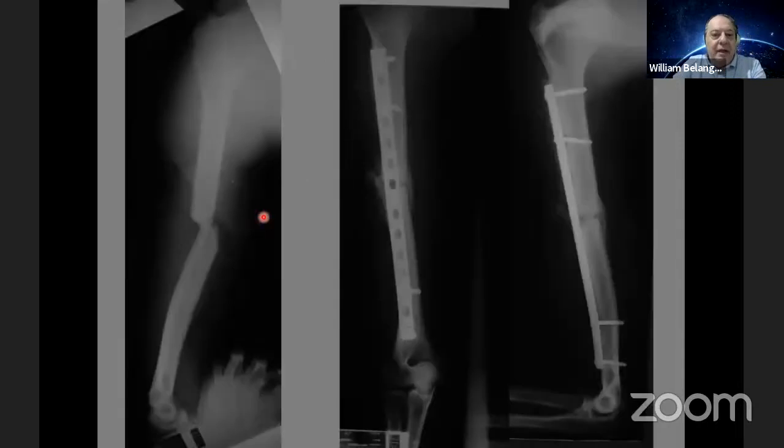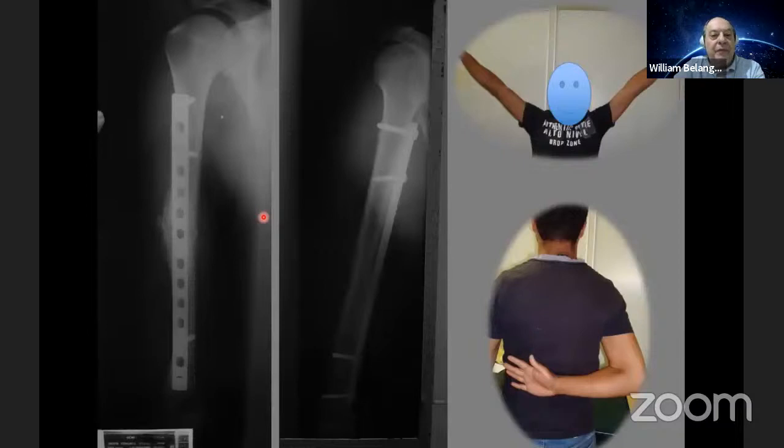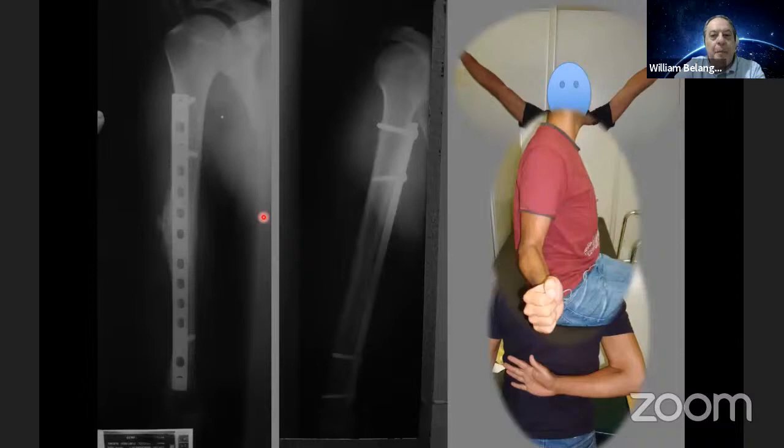You see, this is a transverse fracture treated in the correct way: long plate, 2 screws in each bone fragment, empty hole between them. Very nice consolidation, very good result.